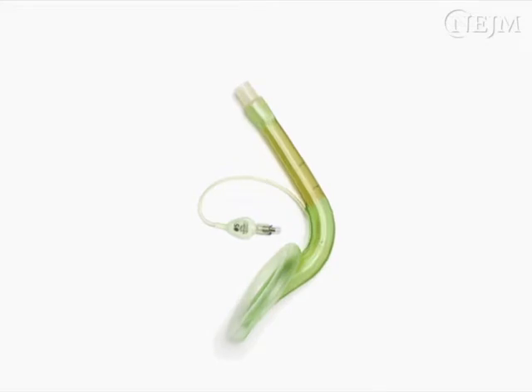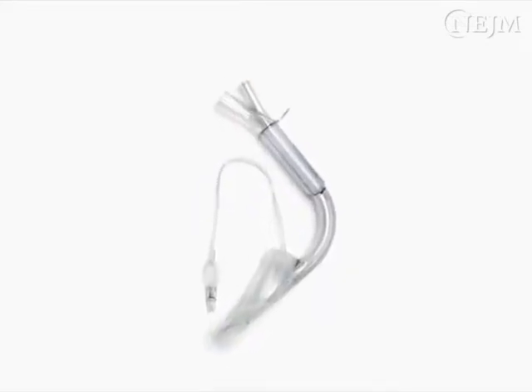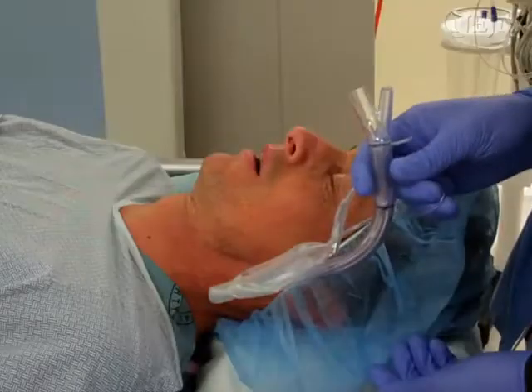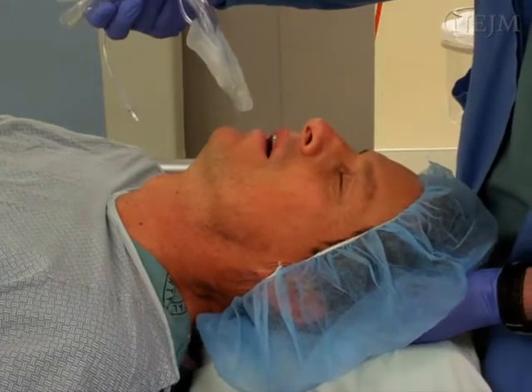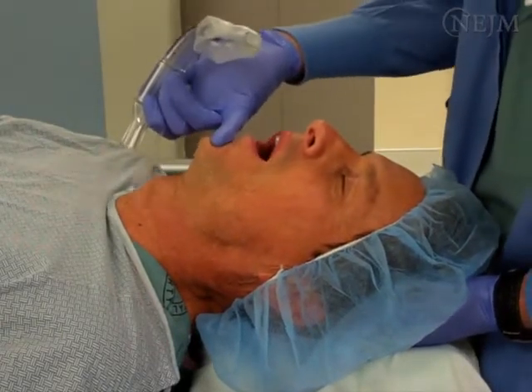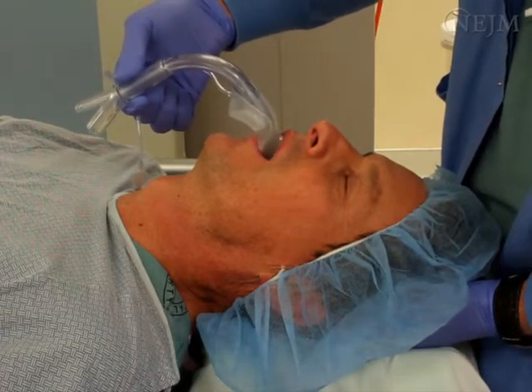Use of a pre-curved laryngeal mask airway sometimes allows placement without the need to insert hands inside a patient's mouth. To place a pre-curved laryngeal mask airway, grab the connecting tube with your dominant hand so the cuff points to the patient's head. Your hand should be in a neutral position with the thumb on the upward surface of the tube.